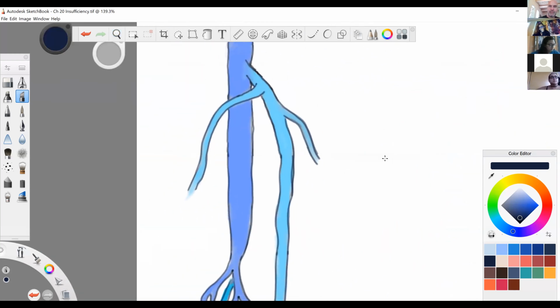I've drawn some things in here, and let's talk about that. I didn't draw the deep femoral veins, so you don't know exactly where that's coming off, but we'll go all the way up here and call that the common femoral vein. And the femoral vein is down here, so let's draw right inside of it. Femoral vein, proximal, mid, distal. Our machines still say common femoral vein because the person who set it up was a dinosaur apparently. Didn't know that we were no longer using, I'm sorry, the machines say SFV, superficial femoral vein, and that's the old stuff.